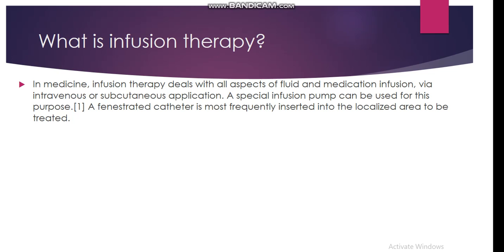Intravenous infusion is a therapy which utilizes intravenous access to deliver medication or fluid. This may be to increase the vascular volume of the patient or deliver medication. Blood transfusion is a type of infusion. However, in this case we are transferring blood from an outside source.